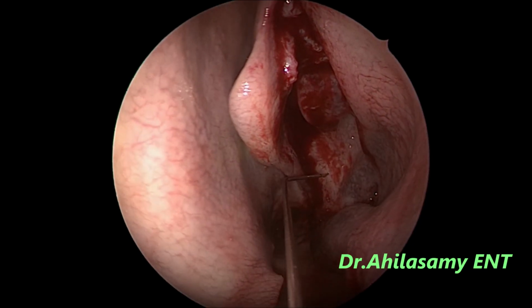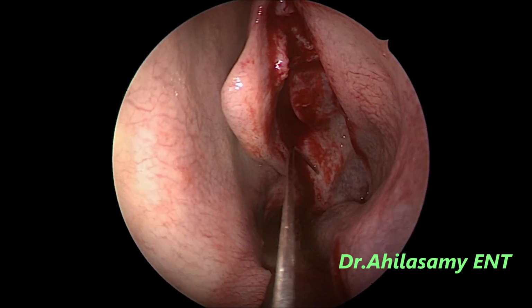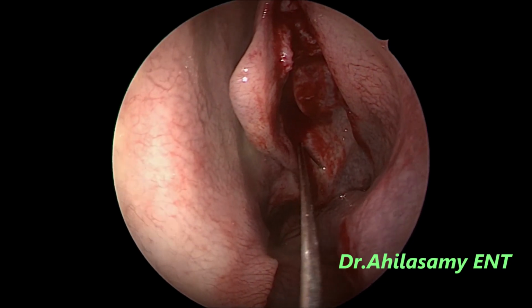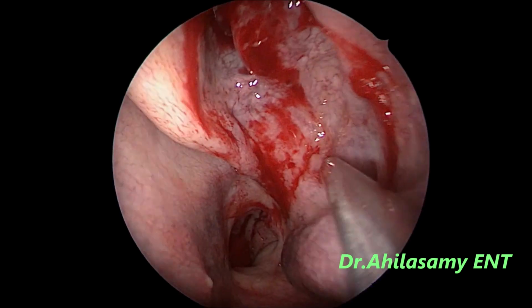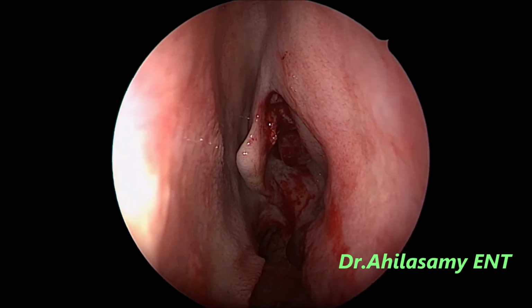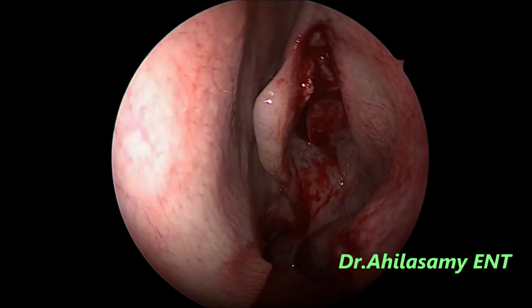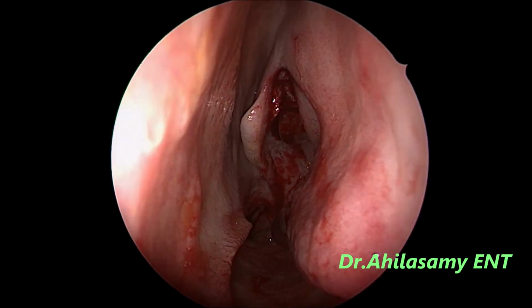Now we have got the normal anatomy after removing the polyp. That's the first step. For added benefit, I am giving a sphenopalatine block after I can see the sphenopalatine area. Now we have got the normal anatomy after removing all the polyps with the shaver system and some for biopsy.